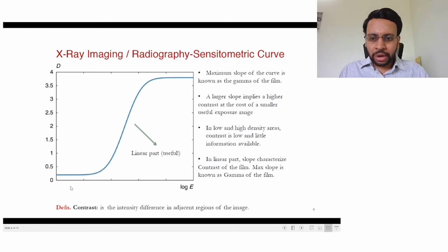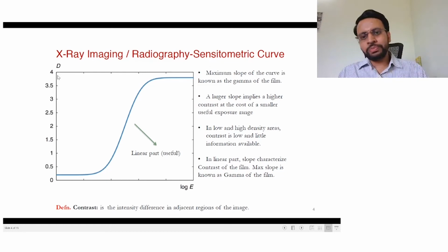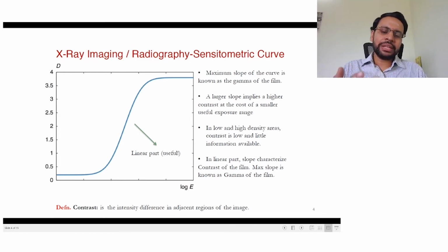When this is small, you won't observe any difference here. Similarly, when this value is too large, the values of intensities to which it gets mapped is also small there, but it is in between. You will have a range over which even a small change in the ratio of input to the output intensity is amplified here. The shape of this curve varies depending on exactly what structures you would like to see with the maximum contrast.